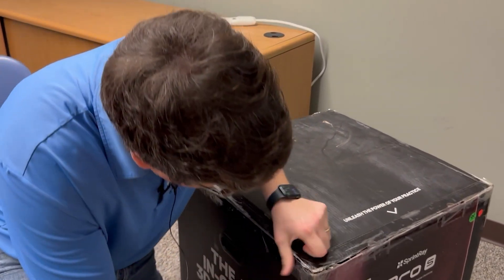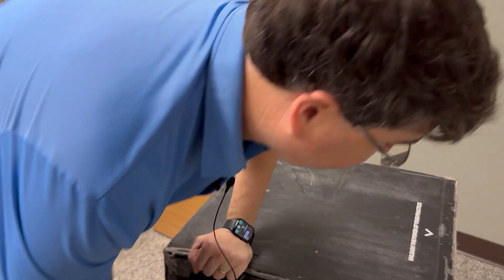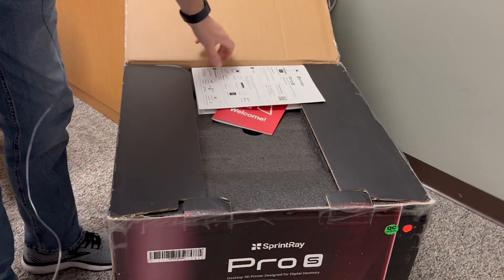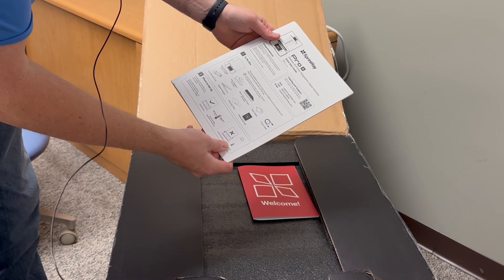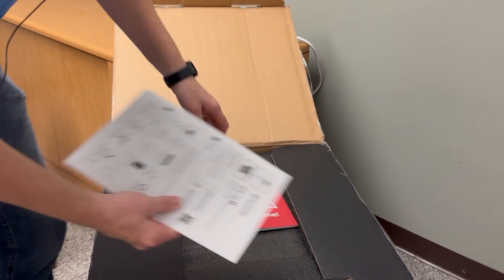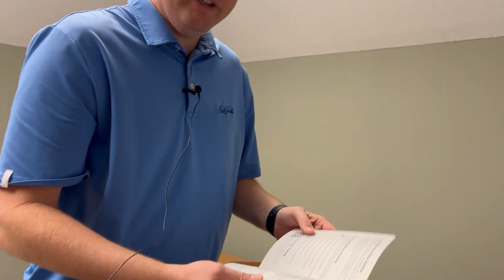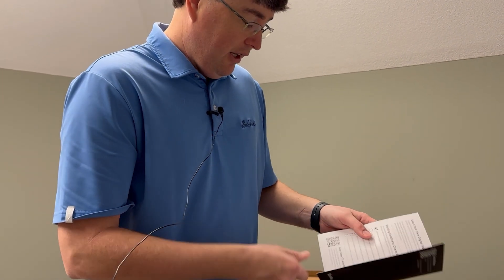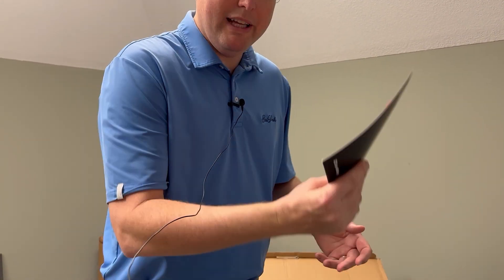So that's a tab — now let's open it up. First thing you're going to see is the Sprint Ray Pro S Desktop 3D Printer Design for Digital Dentistry quick start guide. It tells you what's in the box and where to set it up. Let's put that to the side. We've also got a welcome packet — printing readiness checklist, a new user training QR code, and some important phone numbers.